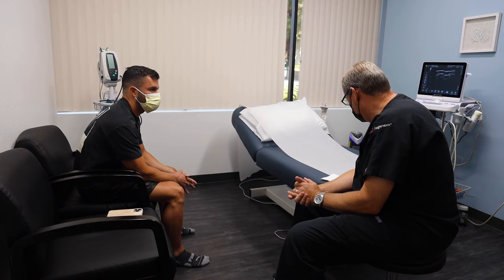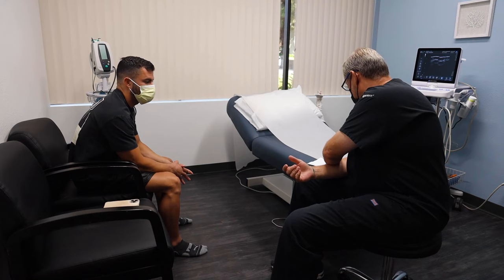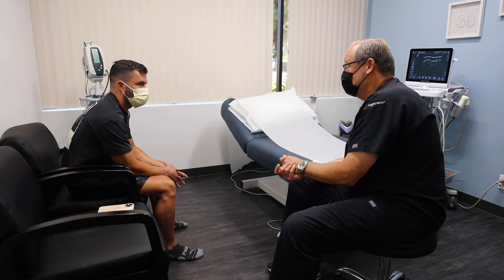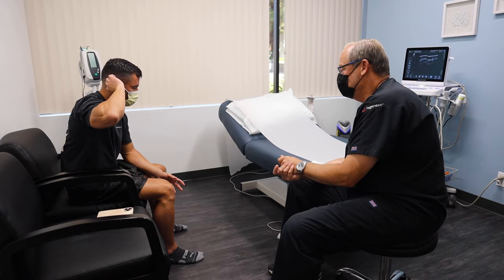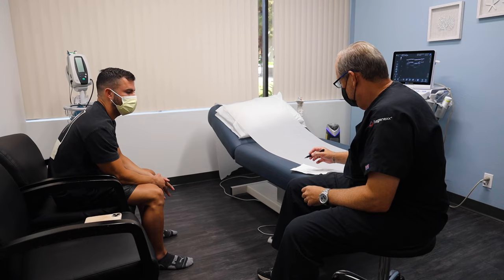For the left shoulder, we have the labrum, the supraspinatus, and the subdeltoid bursa. And for the hip, we're targeting the labrum and the gluteus minimus tendon. So we got a lot. So the right shoulder, I believe there was bursitis or fluid or something going on there as well, or at least that's what the MRI showed. I know once you did the ultrasound, you were saying that actually the left appeared a little bit worse. Right, I didn't see bursitis.